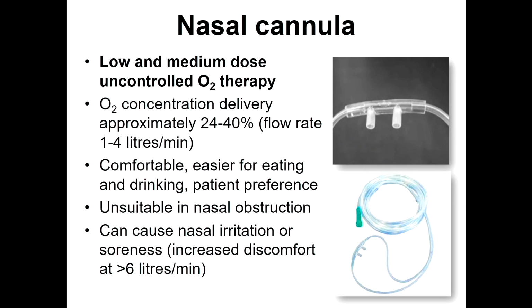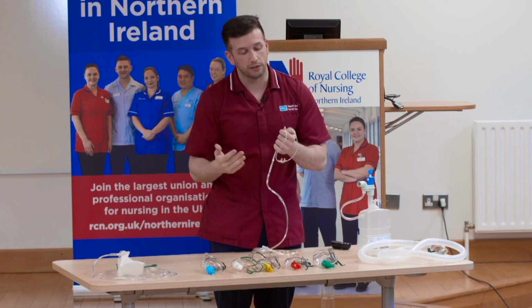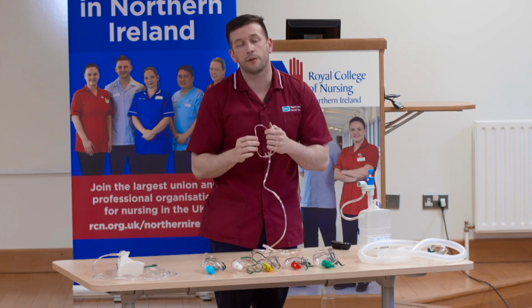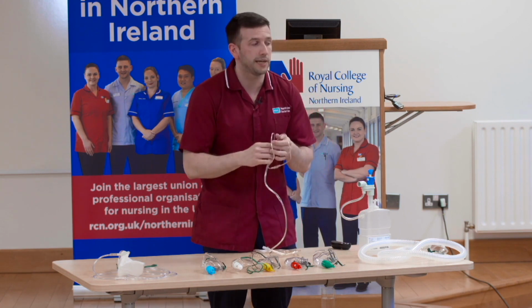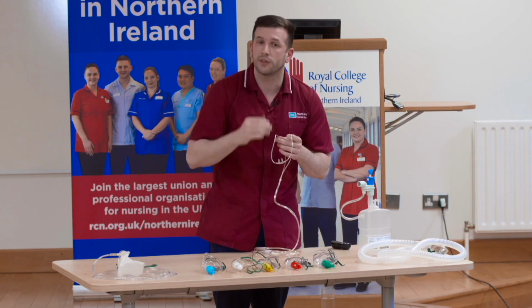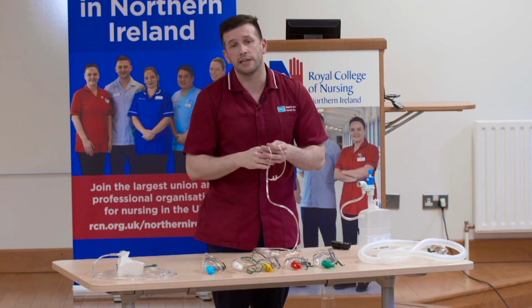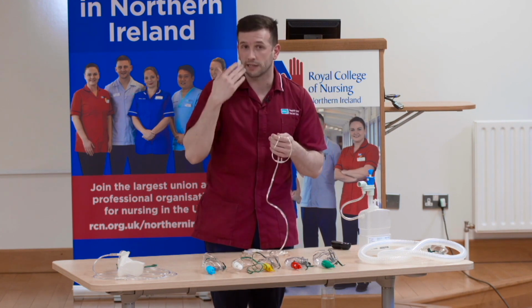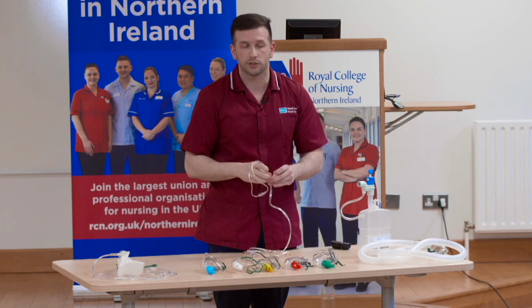When we use nasal cannula, we don't use it for acute oxygen therapy or for people with critical illness. Usually it's an adjunct that we use for patients who are weaning from face mask oxygen therapy, and of course it has a large role to play for individuals that require long-term oxygen therapy out there in our communities. It can cause some nasal irritation, increased dryness within the nasal airways, and in some cases a little bit of epistaxis. If we know that patients have nasal abnormalities, then we try to avoid this form of oxygen therapy. And of course, if they start to get symptoms, for example a nosebleed, then we would consider face mask oxygen as an alternative.